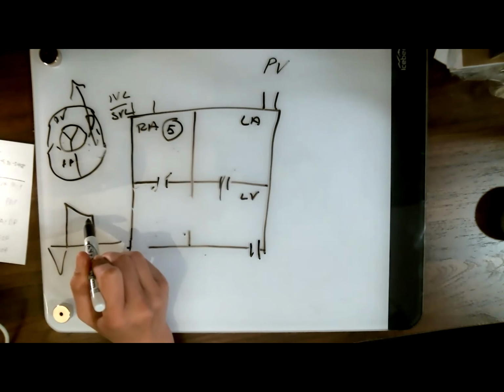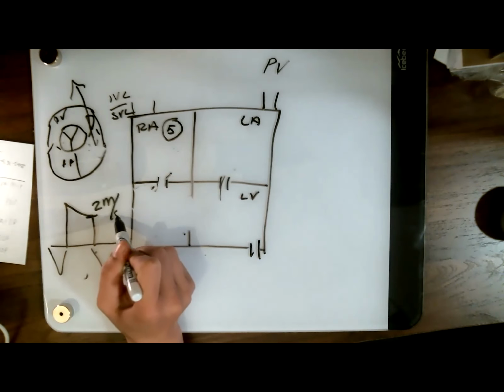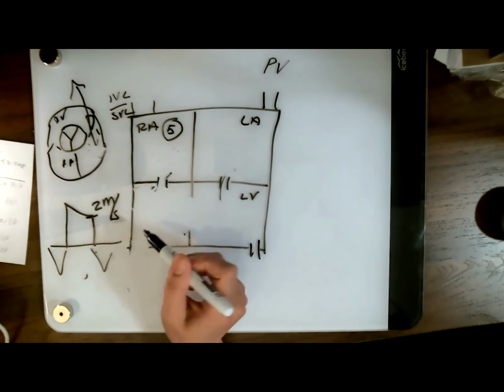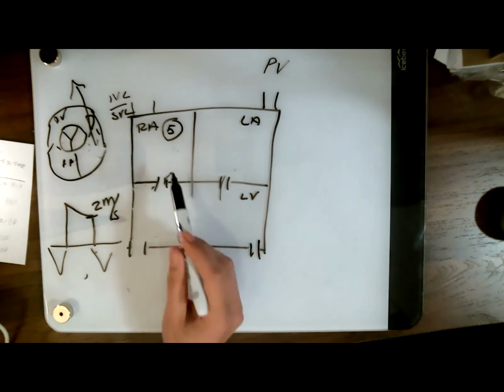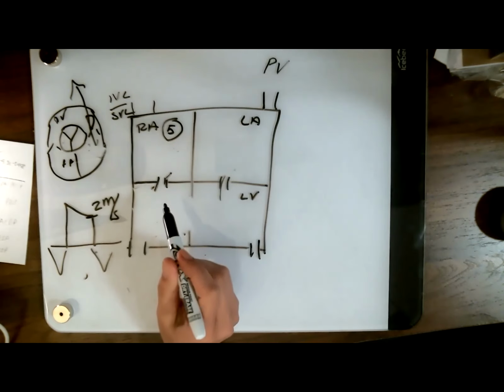And let's give this a number. Let's just make it easy. 2 meters per second is the velocity of your PR jet at end diastole. So now you're in diastole, right? And let's just use an RAP of 5. Okay. So here we are in diastole.